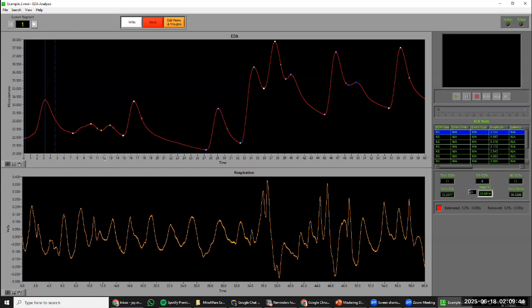So if someone were to use an ECG sensor, let's say on the hand, that has a much higher conductance increase than the EDA ones, and so it's going to amplify all of our skin conductance to a much higher range. If this is done, the data are unfortunately unusable because it's not a constant increase that's occurring here, as their baseline is floating. So be aware of these. Let's try not to use the wrong sensors on these for sure.